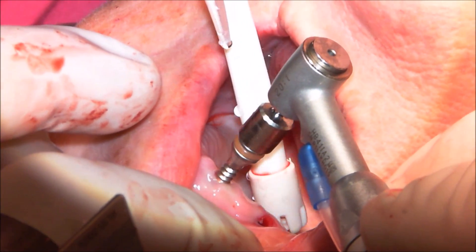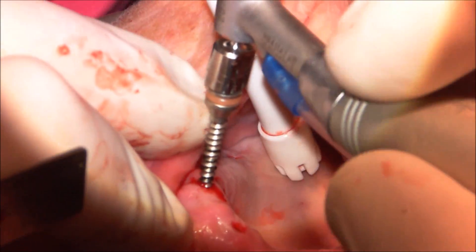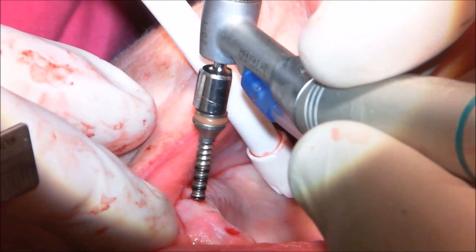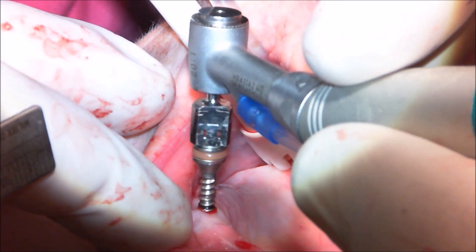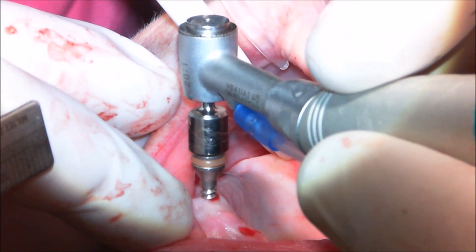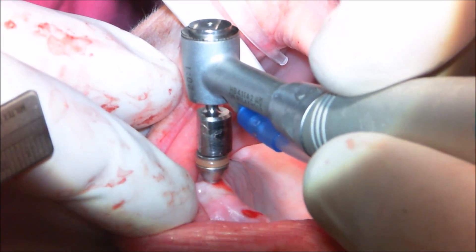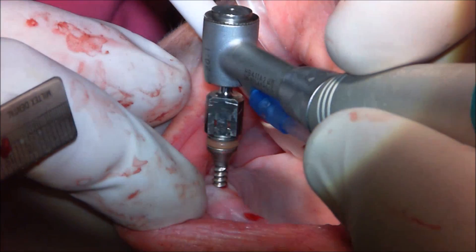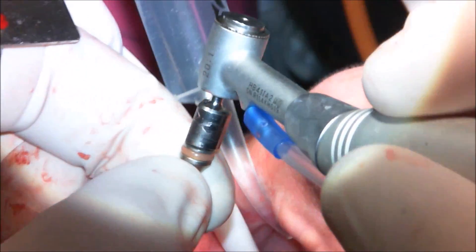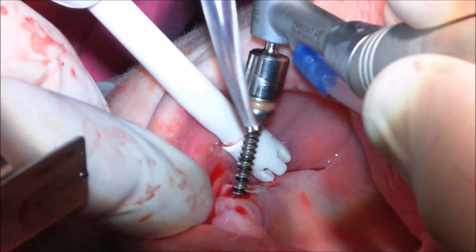I've gone back to the smaller expander for the four anterior sites — the ones receiving 3.5 millimeter diameter implants. I measured all of those sites with the blunt ended probe for depth. I'm not trying to control trajectory whatsoever; I'm letting the expander feed down into the osteotomy that's already there. It's just a matter of letting the handpiece do its work — the expander will track along the correct trajectory within the bone.